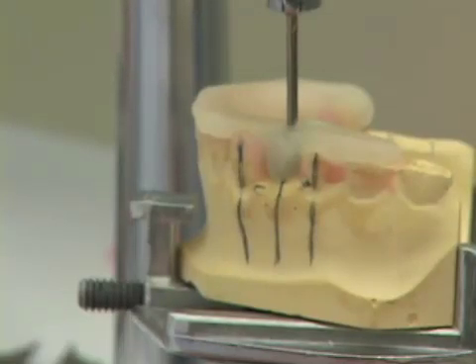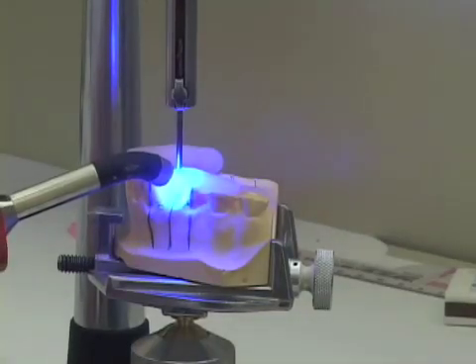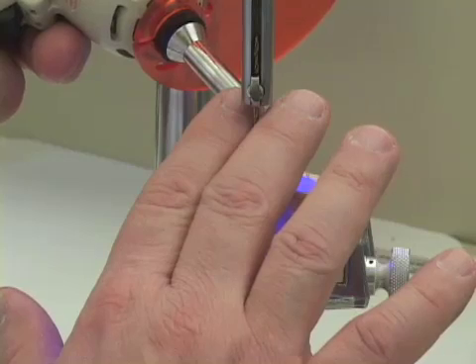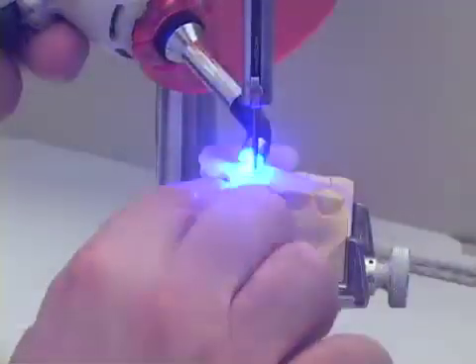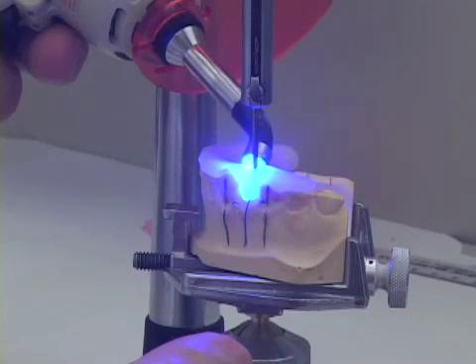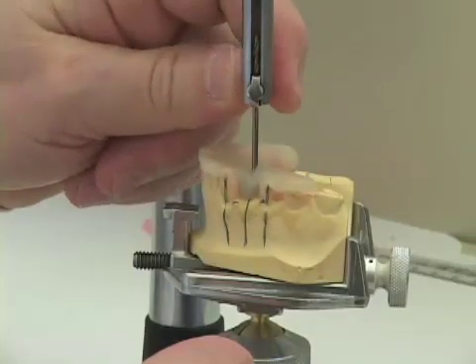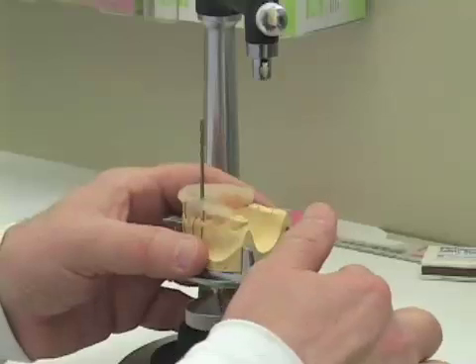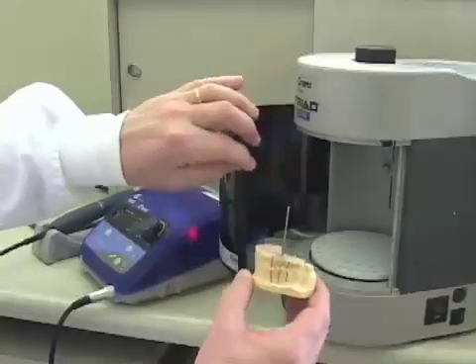I take a handheld light-curing wand and cure this area of triad for 20 seconds from the buccal and 20 seconds from the lingual. After curing for 20 seconds from the lingual, the triad in the area of the drill blank has stiffened and is quite firm. The rest of the triad is not cured yet, so we place it in the triad curing oven for 4 minutes. I then loosen the knurled nut keeping the drill in the surveyor and raise the surveyor free from the drill, carefully removing the cast from the surveyor table and placing it in the triad curing unit.